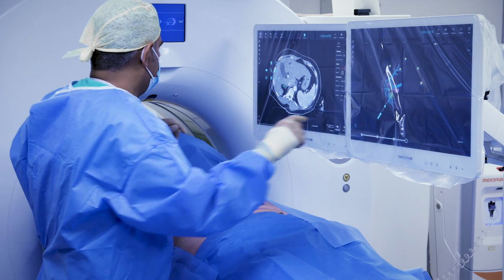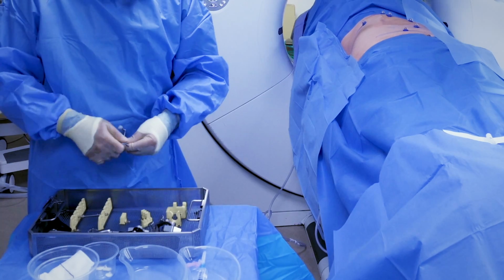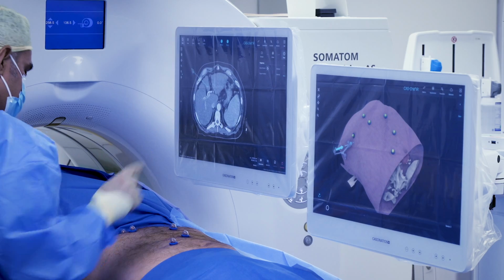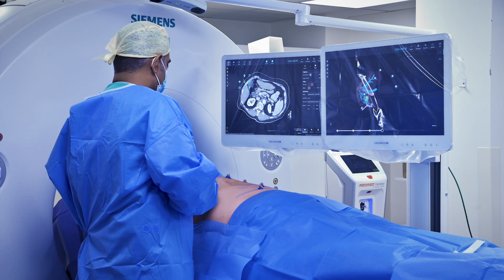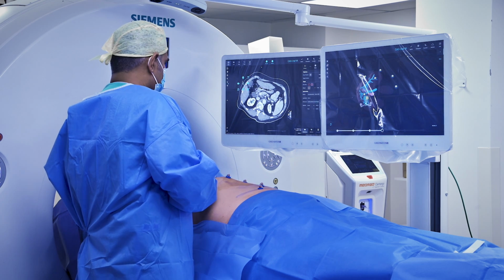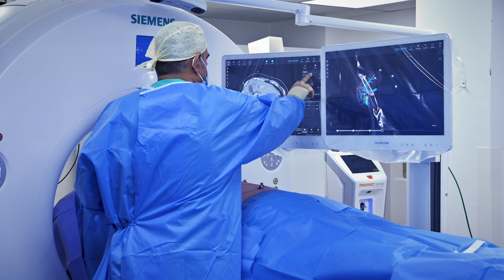Now what we take is the aiming device, which has already got the stereotactic reflective markers attached, and we can kind of see what it's going to look like with different routes that we have planned and where our skin entry point is likely to be. Quite helpfully, it tells us in the bottom left corner of the main screen what the trajectory length is likely to be, which might be, in this case, about 16 centimeters.